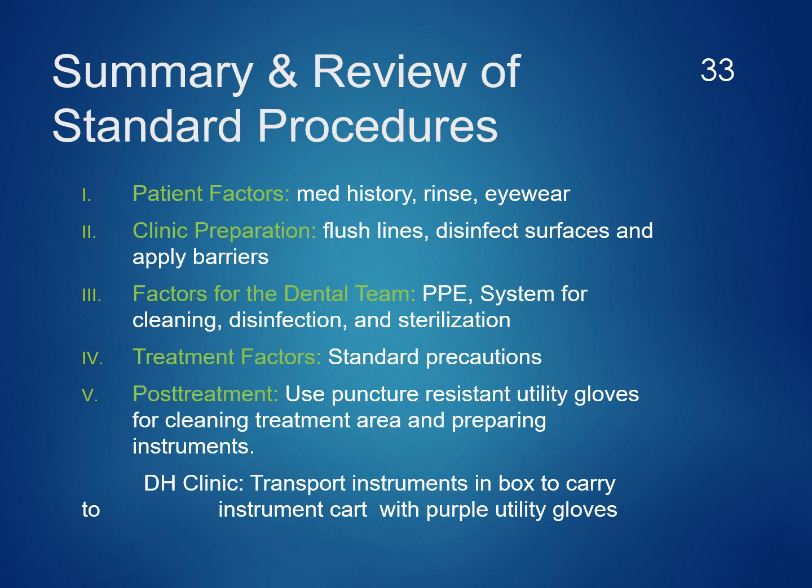So just a quick overview of the procedures as we're going to be going into clinic, and you'll see each other as peer patients, or when you begin to see patients. We're always going to look at the patient factors, and with that we want to look at their med history. We're going to have them do a pre-procedural rinse. We're going to give our patient their protective eyewear always. We're going to have our clinic protection before clinic preparation of our treatment area. We're going to flush our lines at the beginning of the day. We're going to disinfect our surfaces, and then we're going to apply our barriers. Always remembering for our dental team, wearing your PPE.